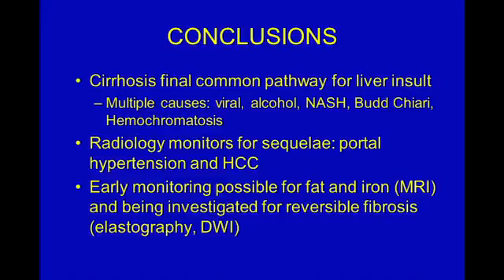But it's being investigated actually for reversible fibrosis in most of our cirrhosis patients by using elastography, or again on MRI, elastography, or diffusion-weighted imaging.